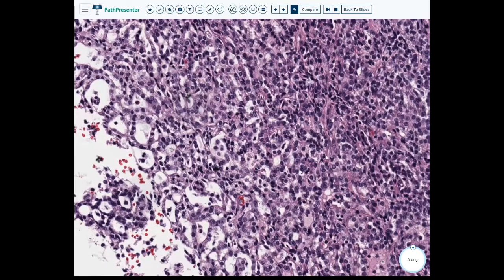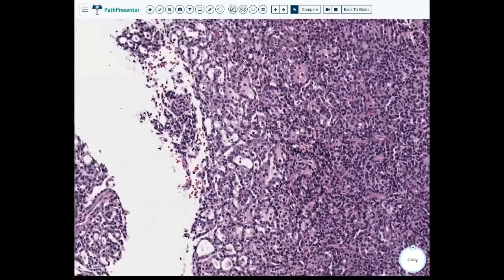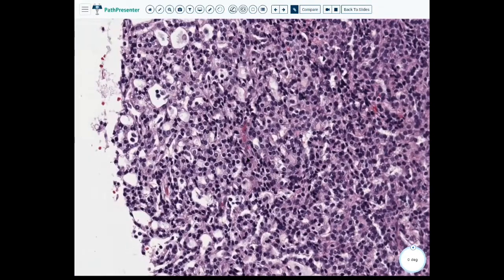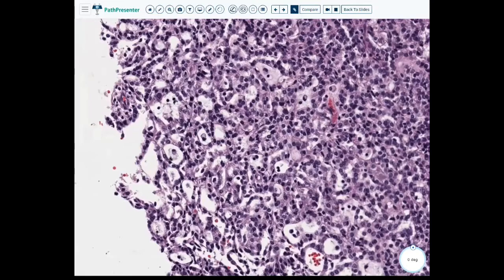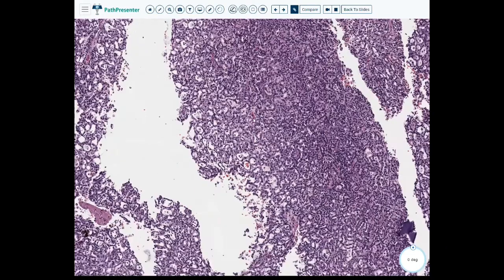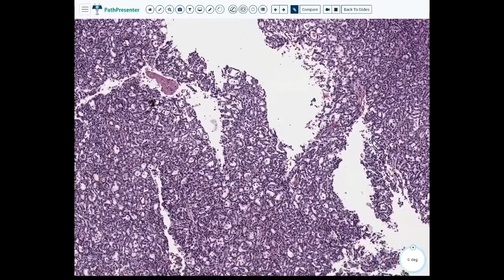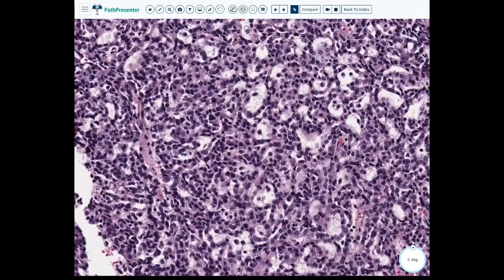You have your thin cores coming up here. It'd be nice if we could find a good area though. Maybe. But what is this not? So this does not look like a clear cell carcinoma, clear cell renal cell carcinoma. This imparts more of a papillary feel where the papillae have just been crunched into a really small area. So they're really looking like they're back to back.